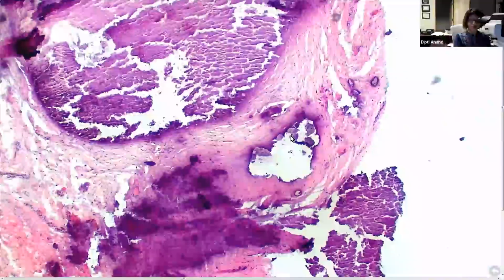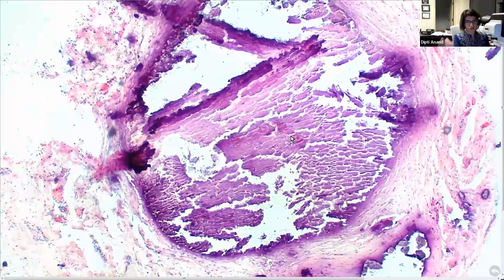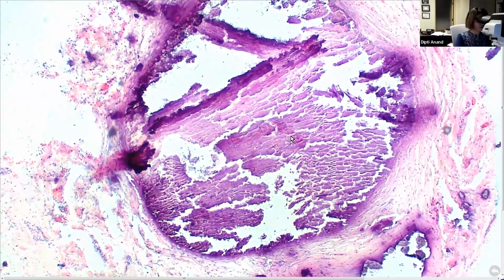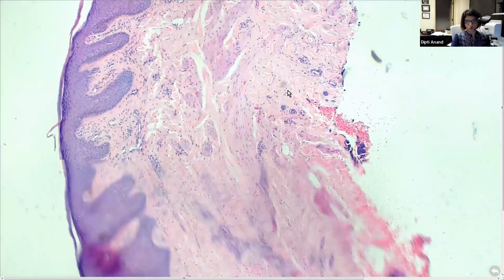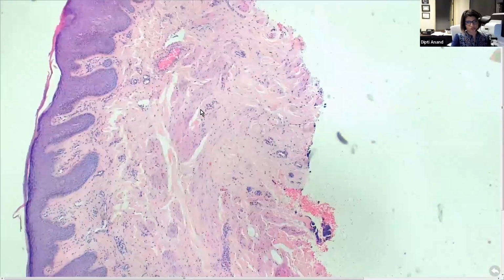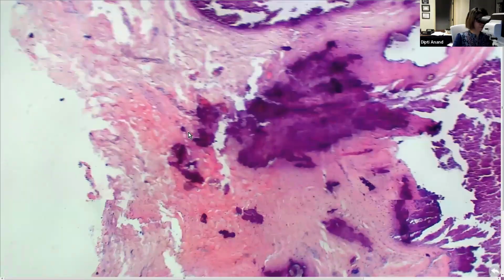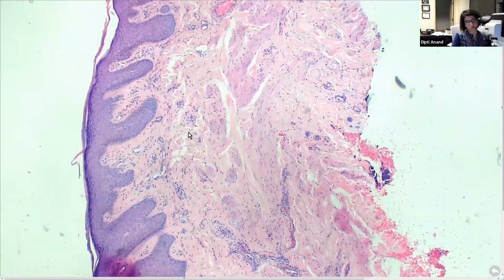Here, the epidermis looks completely normal. And again, in calciphylaxis, the calcium is not that obvious. You have to look for it in the vessels. This is really obvious. This is calcinosis cutis. The different kinds of calcinosis cutis they can ask you are idiopathic calcinosis cutis or calcinosis cutis occurring in a specific site, which is your scrotum, which will make it scrotal calcinosis. And how do you recognize something to be the scrotum? What is all this you see? Smooth muscle. Dartos smooth muscle of the scrotum. So calcium deposition on the scrotum, scrotal calcinosis.